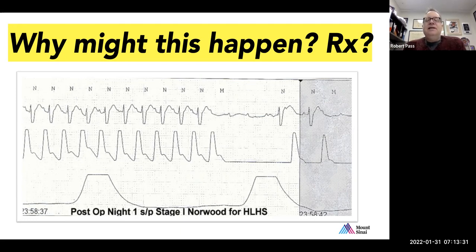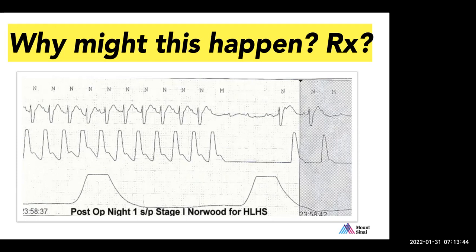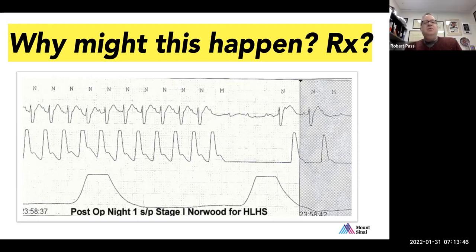So is VVI pacing the best way? How important is it to have AV synchrony at this stage in this patient's post-op course, would you say? I would say very important. Very important, right. And that's an important point, right?